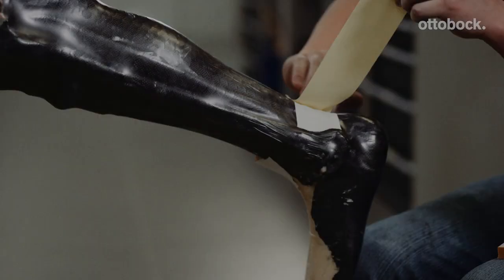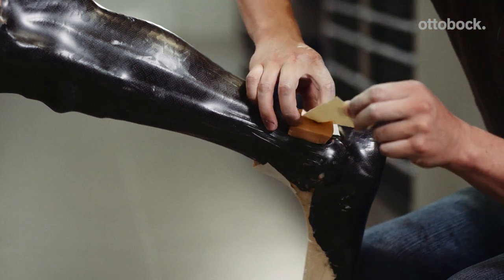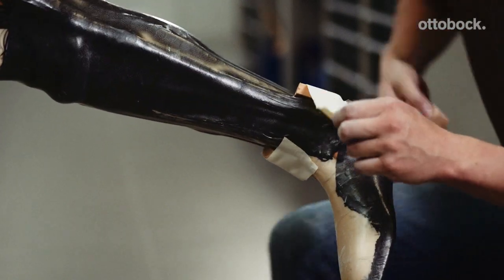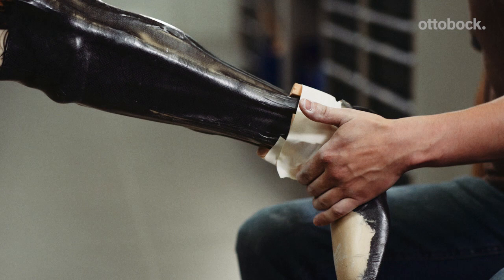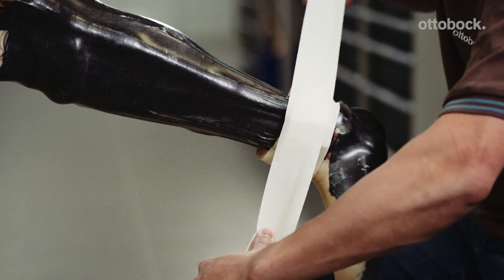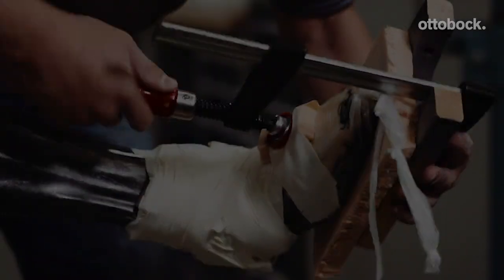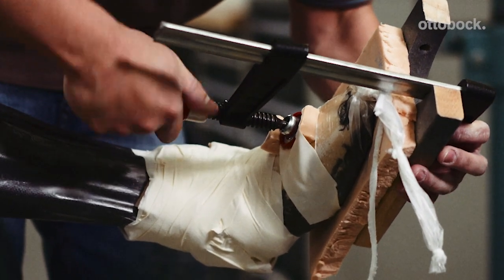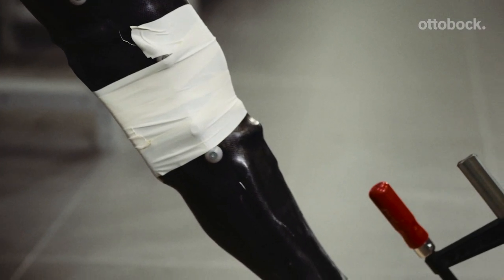Stick strips of Pedalin over the lamination bars for the medial support and ankle joints to prevent excess resin from accumulating in these areas. Press the foot flat with minimal resin accumulation on the forefoot. Allow 10 hours for the model to harden in vacuum at room temperature.